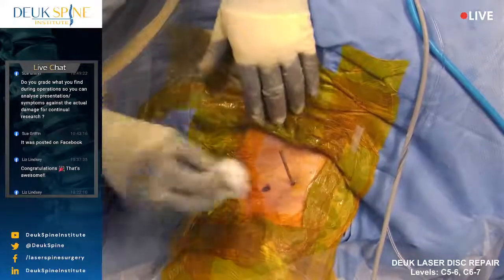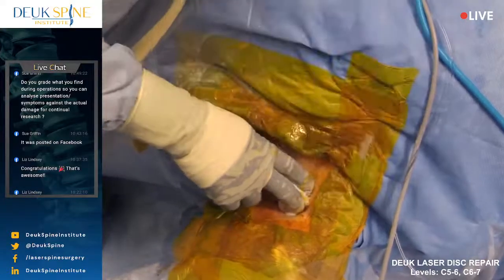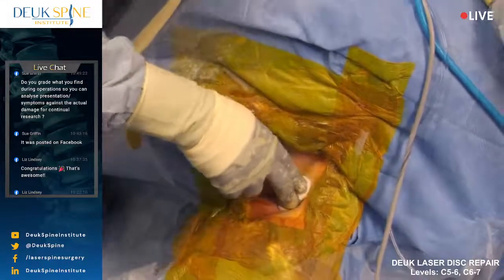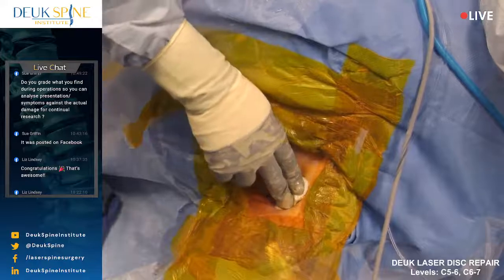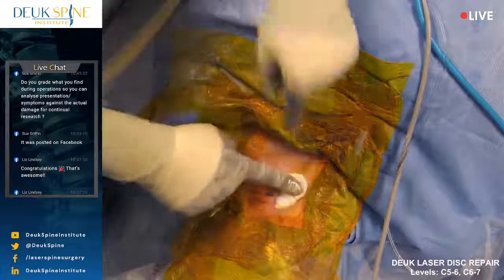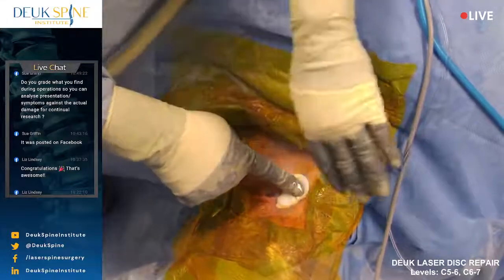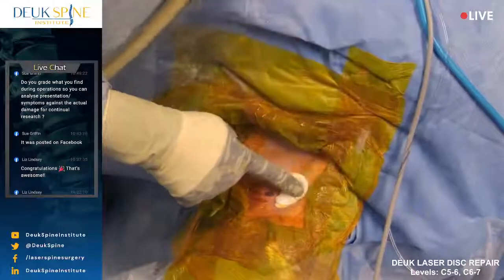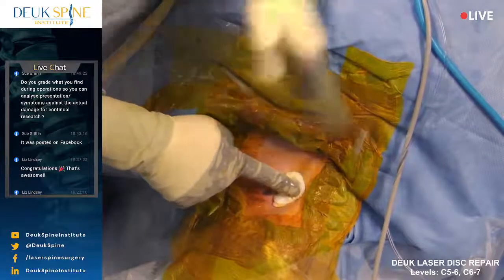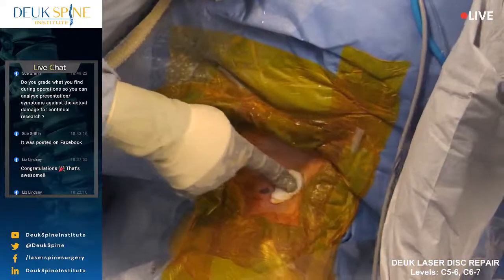And the whole surgery is done through this little metal straw. Now we may get a drop of blood here when I come out. I'm going to apply pressure. So one of the reasons we don't have blood loss is we're not making a big opening. And in this type of surgery, when you do an ACDF or an artificial disc, you got to dissect tissues. You got to cut tissue. You got to cut muscle. All those tissues bleed. Veins bleed. So unless we accidentally hit a vein, which is so rare to actually hit a vein with the needle, we're not going to have bleeding.